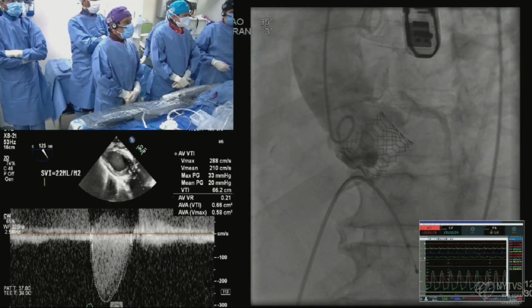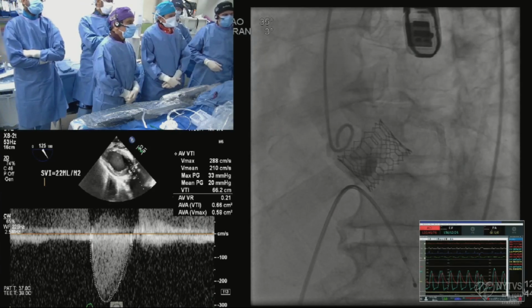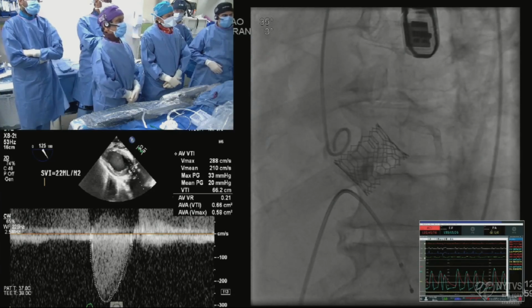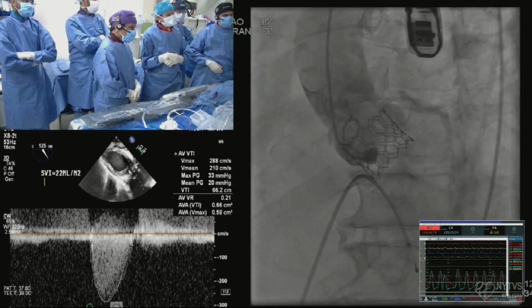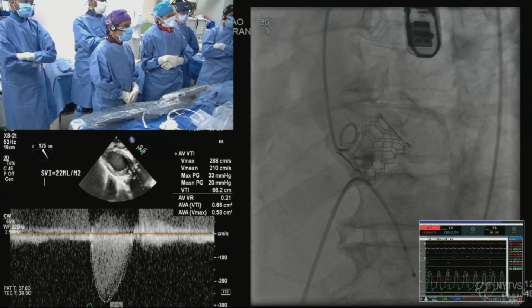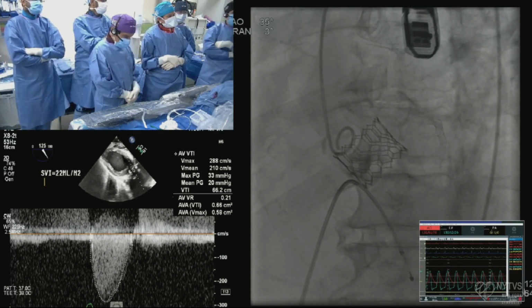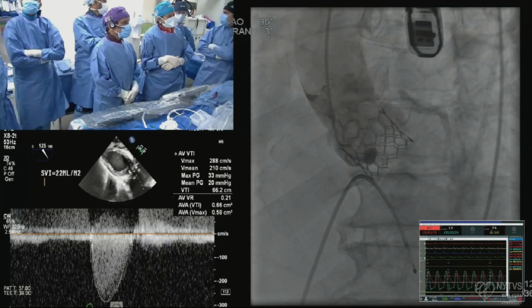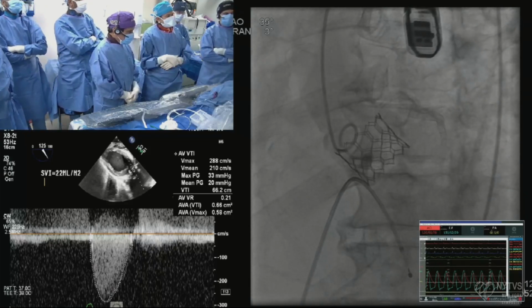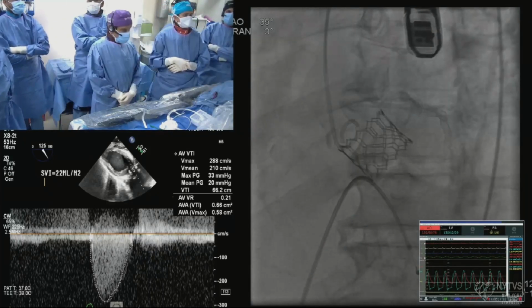All right. Now, actually talk about the angio here, Sahil. Yeah, so the angio looks like a well-seated valve. I think our coronary risk plane is very high up, so I'm not really concerned about any coronary issues during the procedure. But definitely, you see that dye staining in that leaflet, which is very interesting. Everyone talks about HALT in CT scans and echoes. I think there's some significance that the leaflet, the way it's staining all that dye, is not just sinus. I think there's some HALT there as well. So just something to be cognizant of. Again, high risk of stroke in these cases, but unfortunately, I couldn't do anything because the radial was used for a pigtail here.